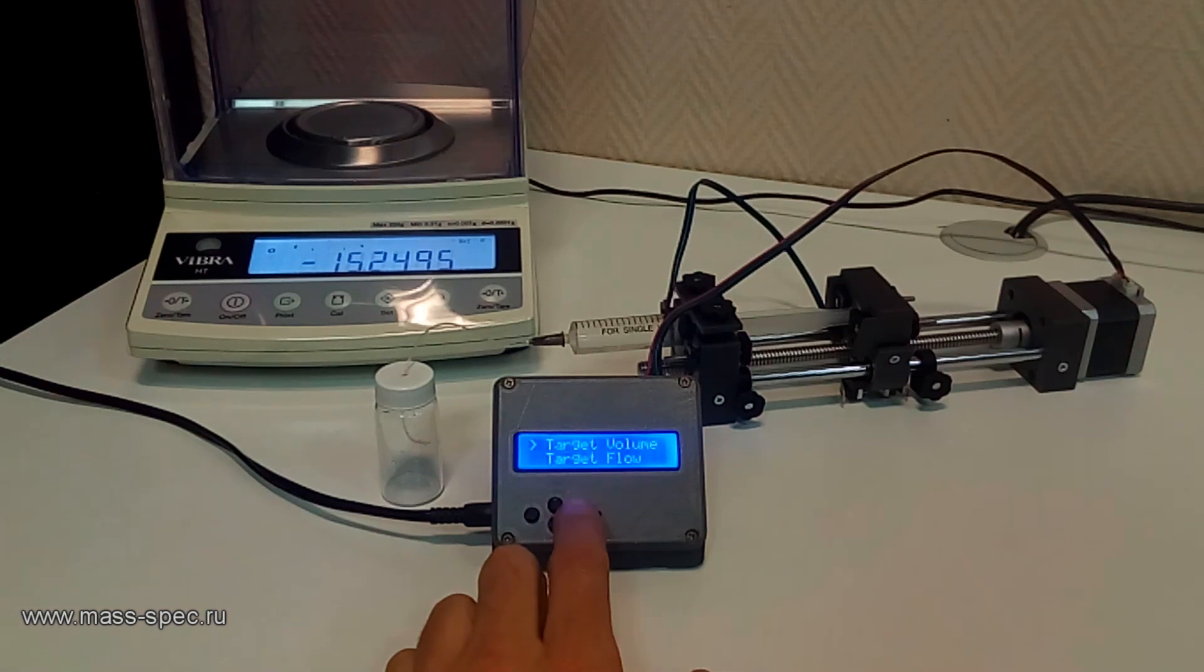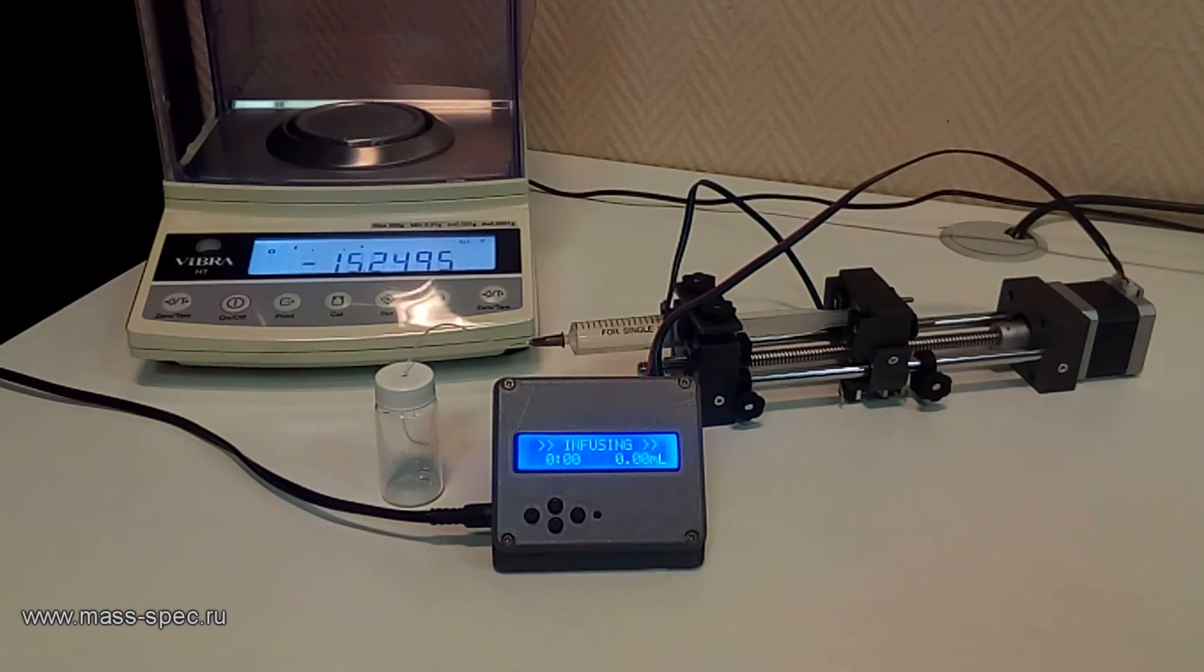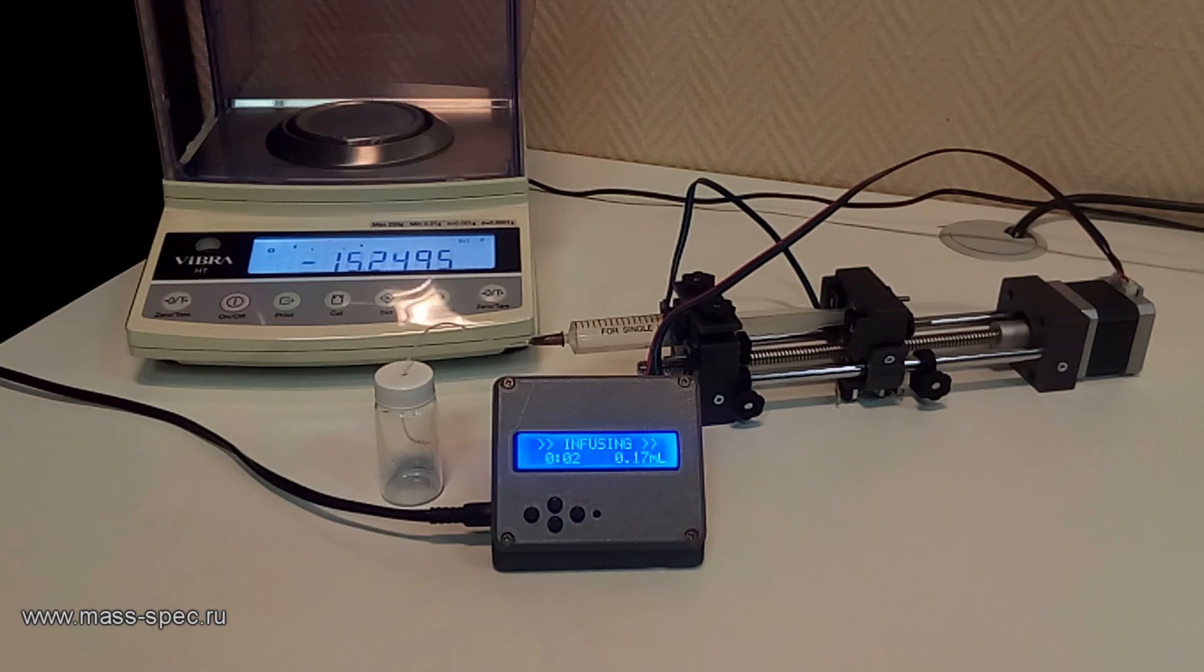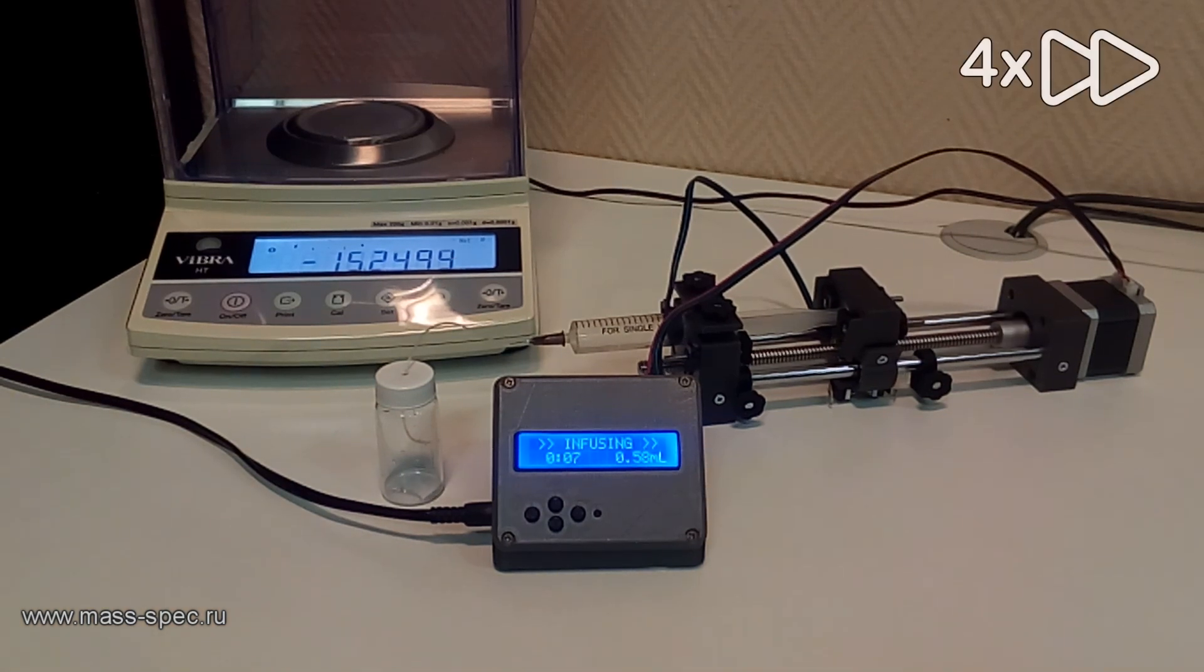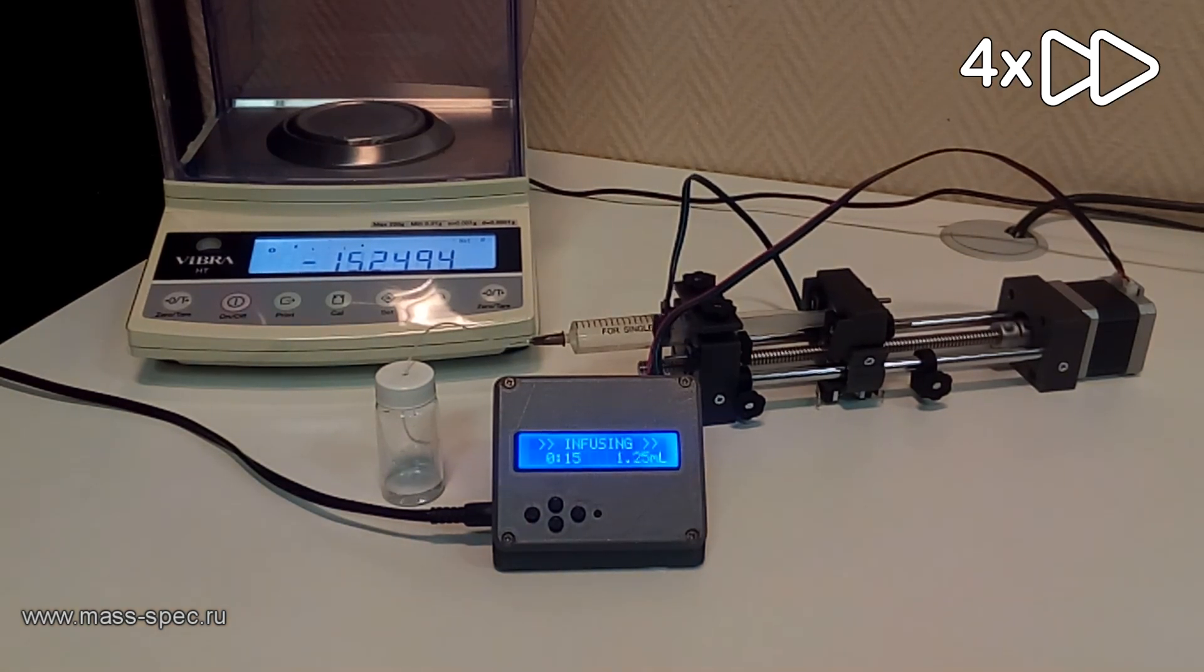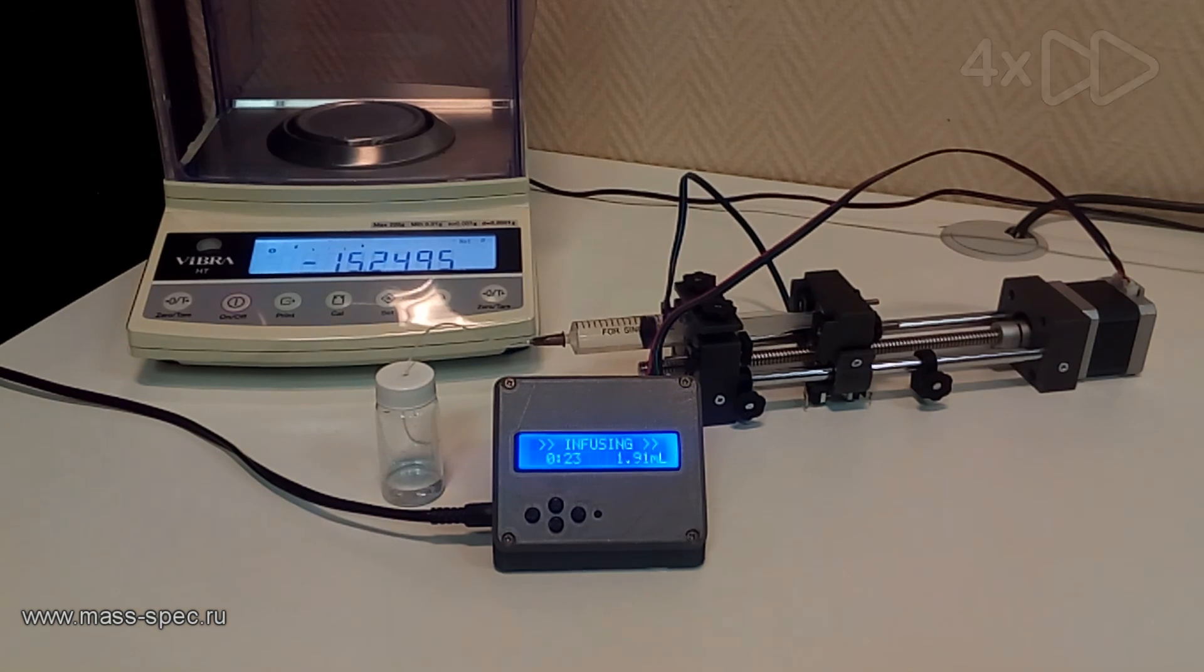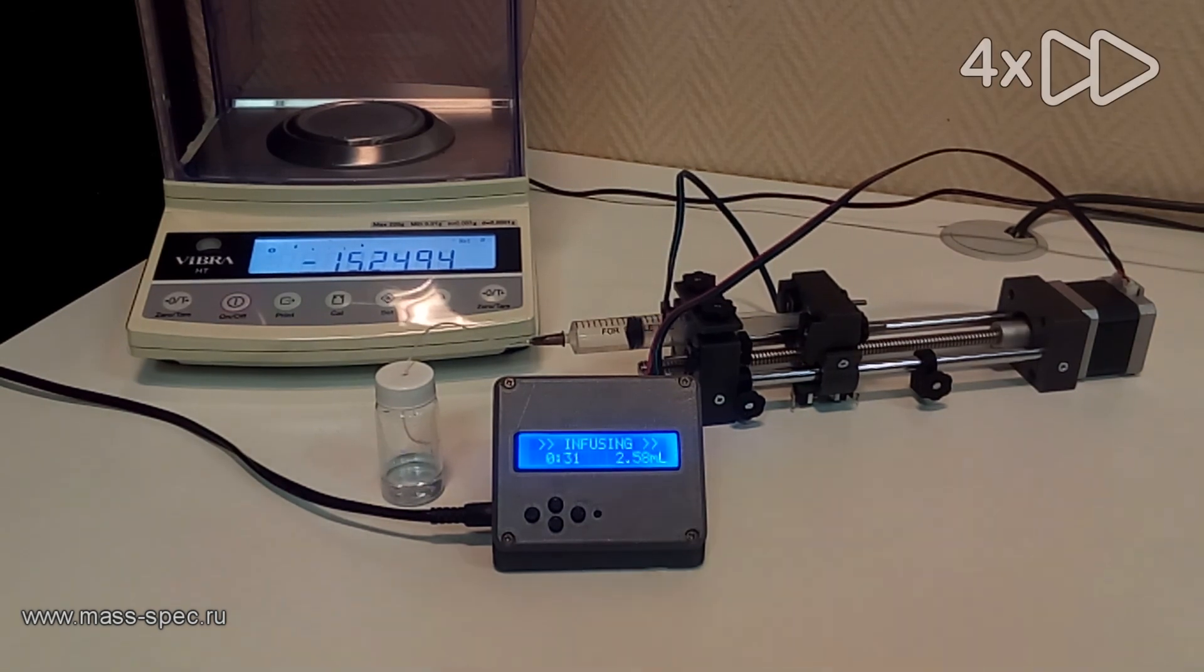At the calibration stage, the target volume is set to 5 milliliters. The length per volume coefficient is equal to 10 mm per milliliter. Therefore, during infusion, the carriage will move forward 5 cm.